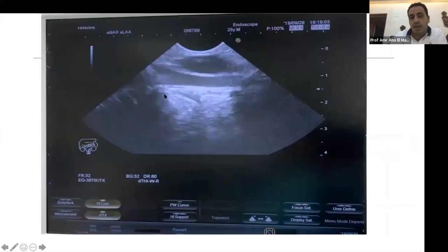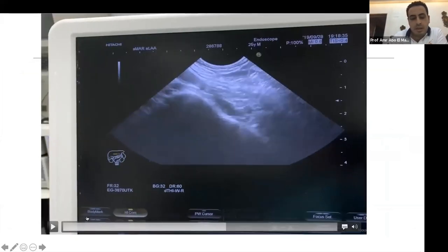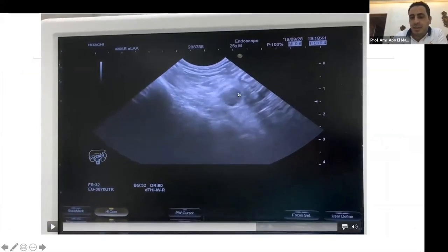Another reason, and this is a simple case of pelvic tumor, is that we can easily identify a malignant para-iliac lymph node. The presence of a malignant node para-iliac, or an iliac vessel lymph node, is a sure sign of malignancy and changes your decision for the surgery.